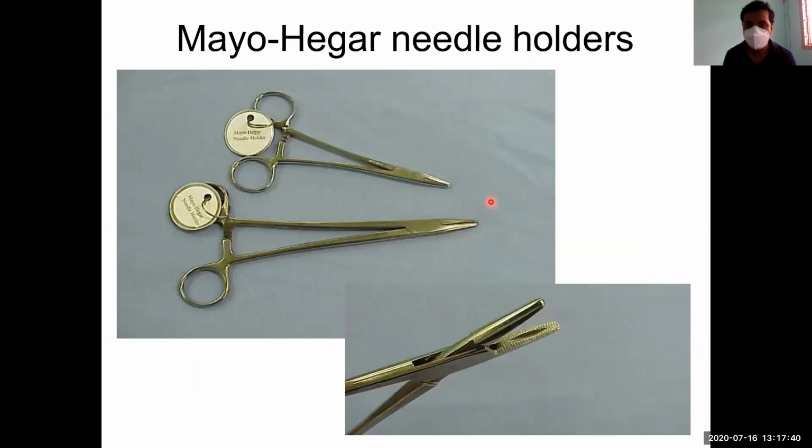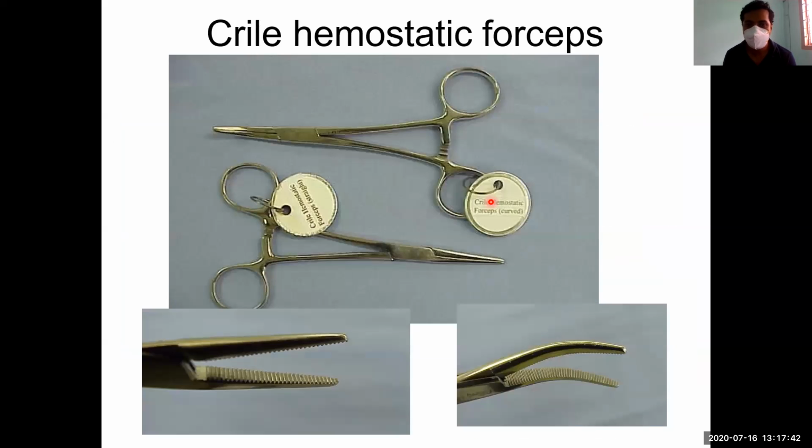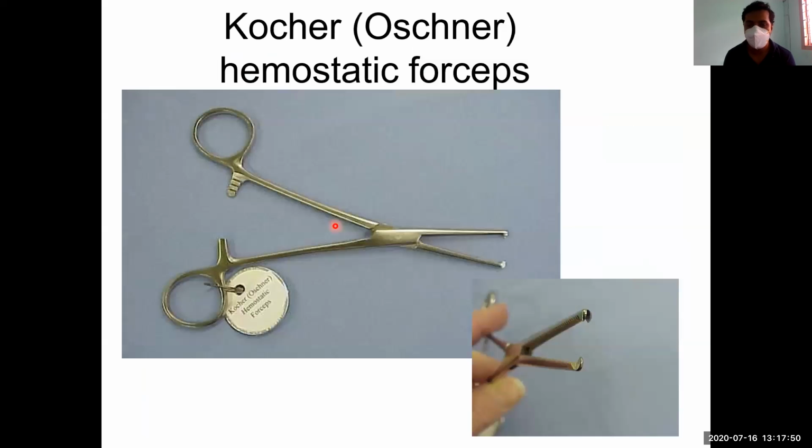See, does it have any gap? No. It opposes completely, so it doesn't have one. Kocher's hemostatic forceps also oppose completely. Though it has teeth at the tip, Kocher's hemostatic, remember we discussed it in the last class. It has a tip in front, but it opposes completely, so the tissues that come in between get crushed.